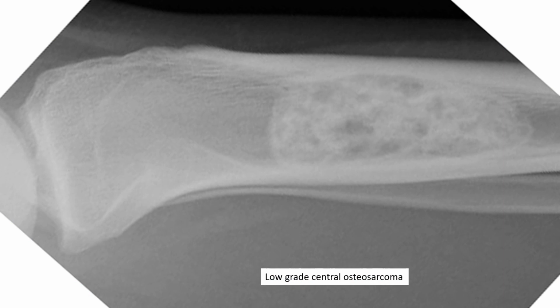The other entity you must consider is an osteosarcoma. In this case, I'm specifically referring to a low-grade central osteosarcoma. This is a tumor more often seen in the jaw and in the tibia. It, by definition, is an intramedullary lesion. This particular lesion actually looks a little circumscribed, and although most lesions could look infiltrative, I've certainly seen my share of less infiltrative lesions, at least radiologically speaking.